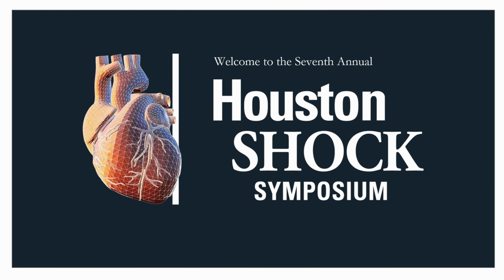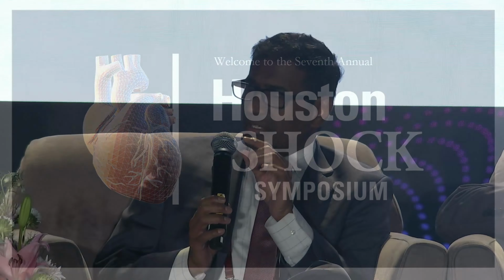Esther, as a heart failure cardiologist, I think we all talk about balloon pumps and how they work in chronic heart failure. As a comment and a question, I think a part of the physiology of the balloon pump that is understudied is the Windkessel effect of the aorta and the stiffness of the vasculature that goes through remodeling in a heart failure patient. We think about myocardial remodeling and then get fixated on the cardiac output. But at least in my experience, these patients who have vascular remodeling in chronic heart failure seem to respond better with a balloon pump.